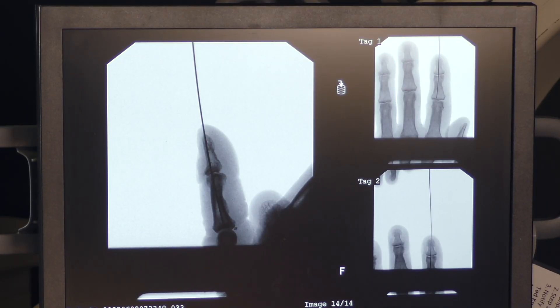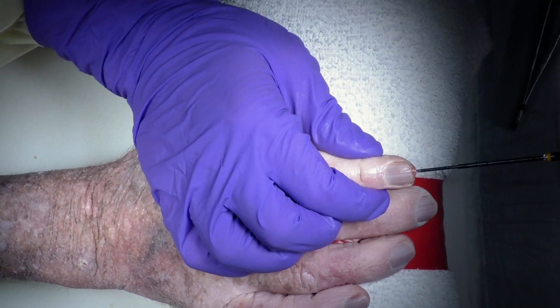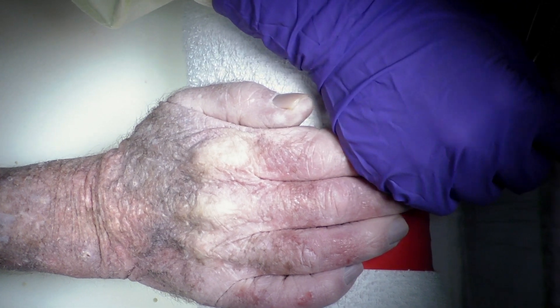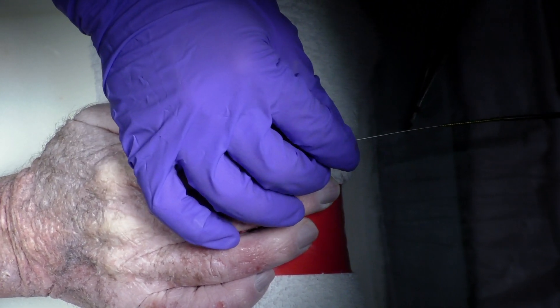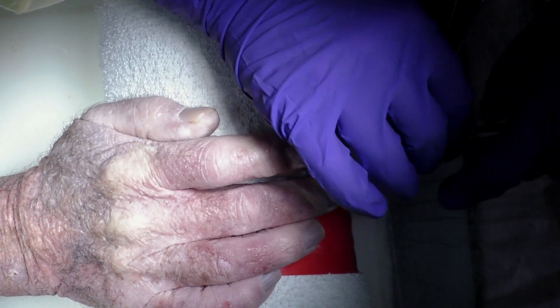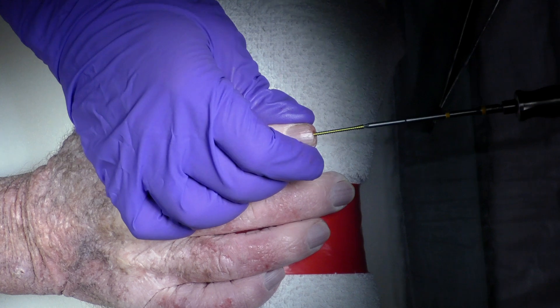We'll place the 30 millimeter screw over the guide pin, and I'm holding the distal phalanx with the joint reduced — depending on the releases you had to do and the joint preparation.